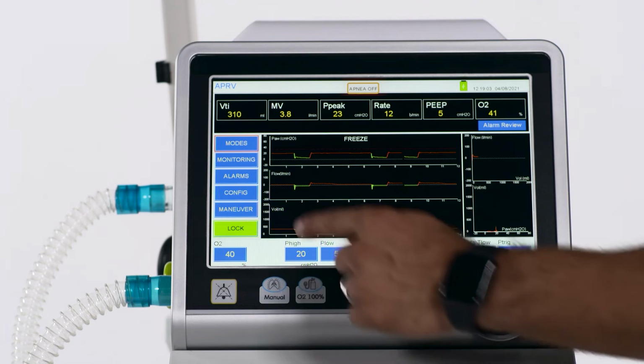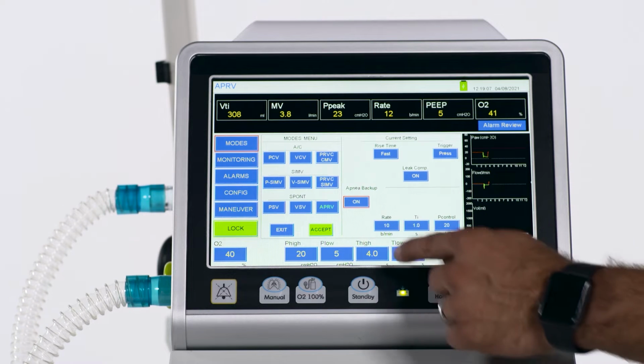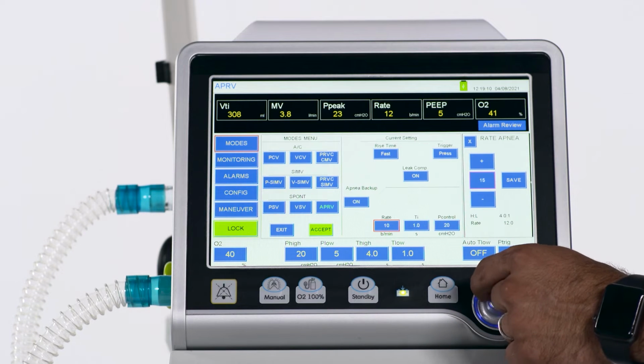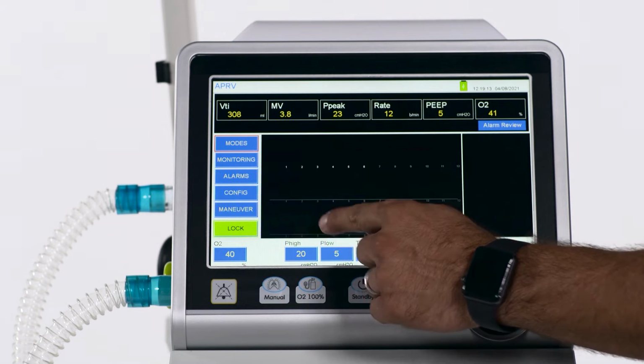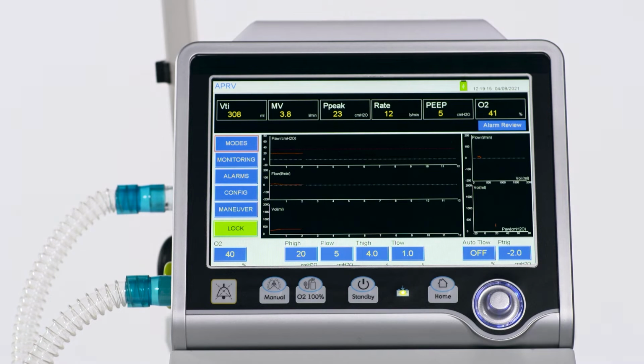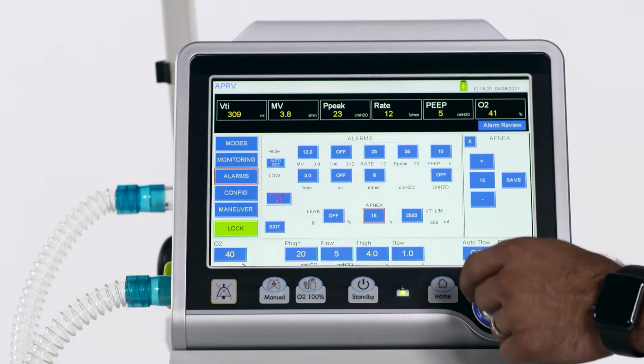The system is able to detect apnea. In spontaneous mode, you can activate or inactivate it in the settings of this mode. If apnea is detected, the system switches automatically to AC/PCV mode and the alarm message will appear in an alarm window.